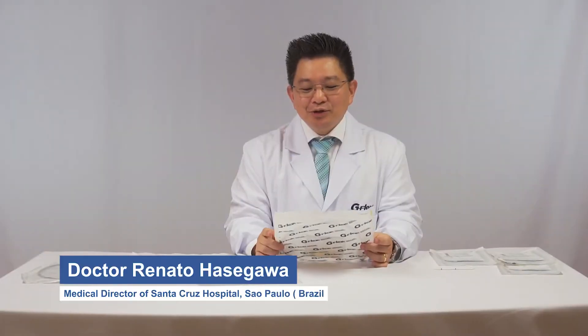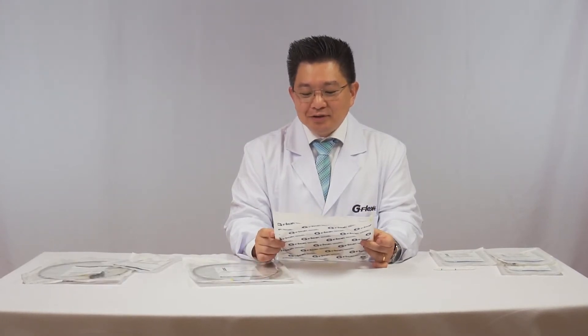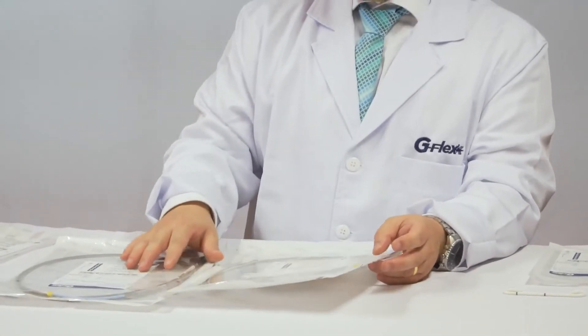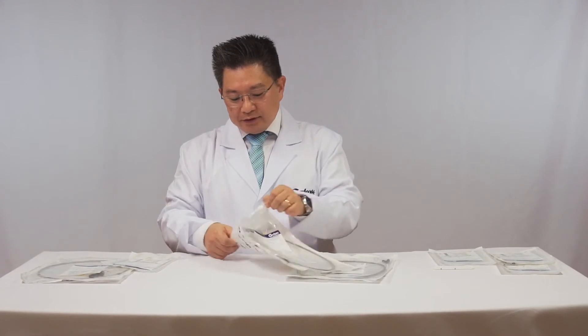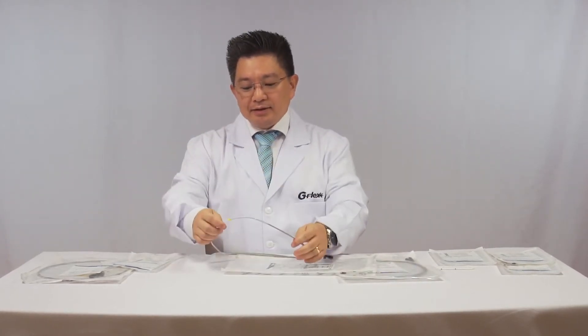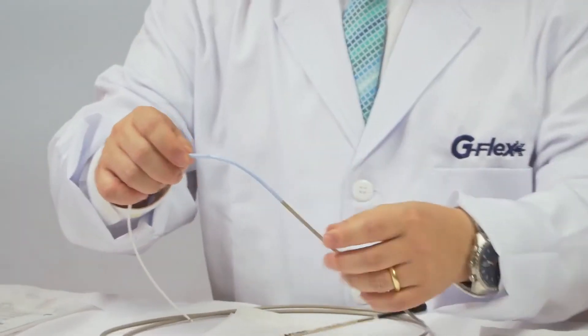In this video I will show plastic stents available from G-Flex. We have a wide range of stents. It's a very affordable and very reliable equipment. It serves for several situations, from benign strictures to malignant strictures.